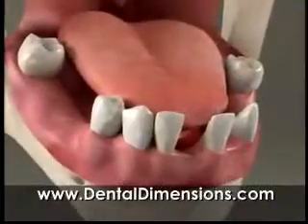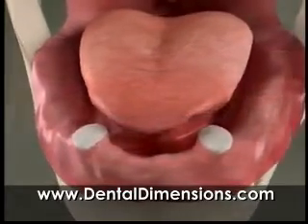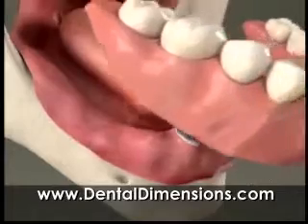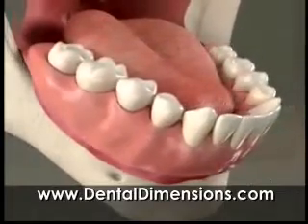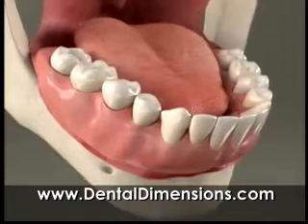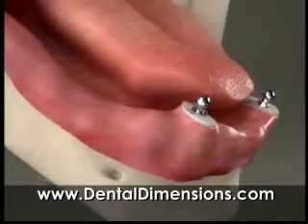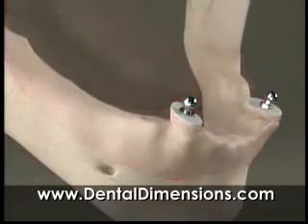So if you have some teeth that can be saved, we may recommend that you keep them and wear an overdenture. Overdentures are dentures that are held in place by some of your existing teeth. This allows them to be more secure and feel more natural than conventional dentures. And because we are leaving some of your natural teeth in place, bone loss is slowed significantly.